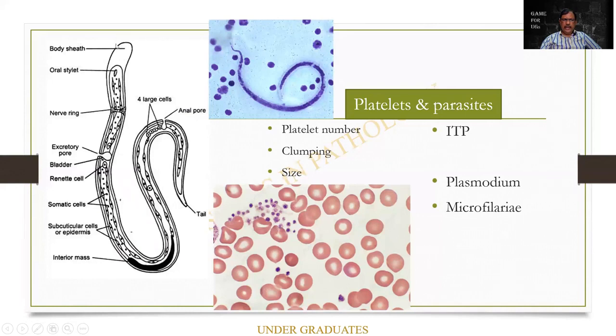It has a blunt head over here, and then there is a sharp tail, and the tail end is free of nuclei. All these dark dots are called the nuclei. The other structures you can read in parasitology. This can be kept for the spotter in the examination.